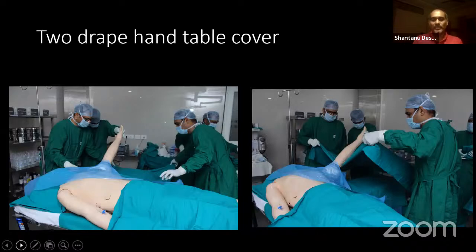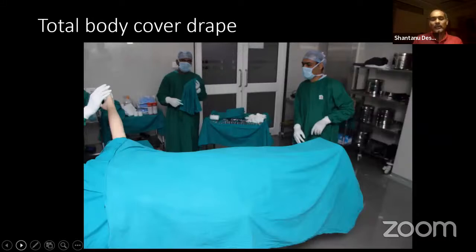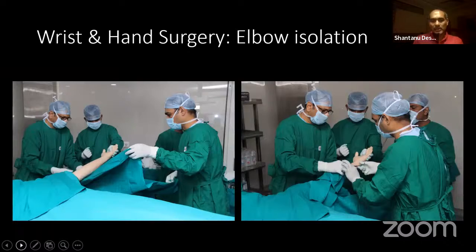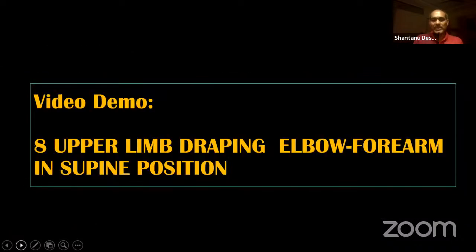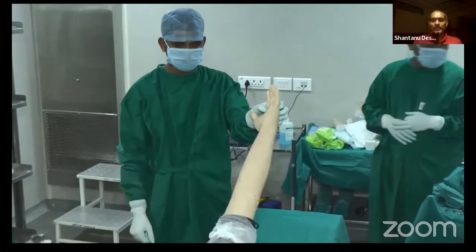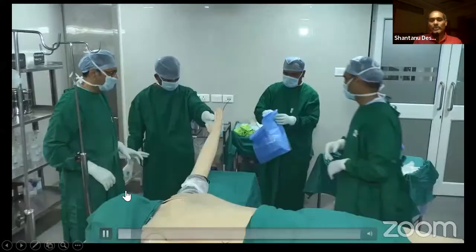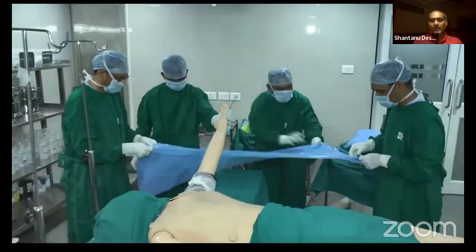We will be using a few drapes on the trolley as well as on the body that we will appreciate in the video, and we have to really make sure that the entire body is covered at the end, including the head end. Elbow surgery, wrist surgery, depending on the area, the isolation can be variable as per your incision. The assistant is holding the arm. You can actually make the assistant wear a sterile gown so that even if it inadvertently gets touched to the trolley or hand, there is no contamination.